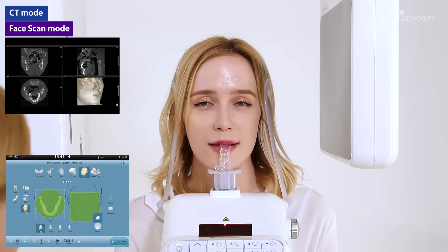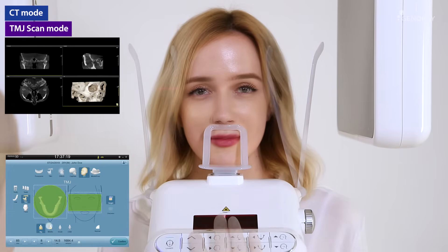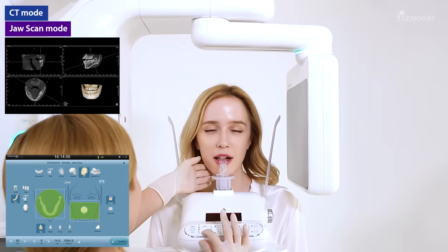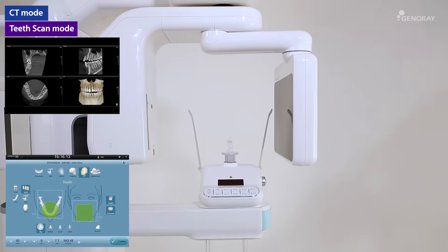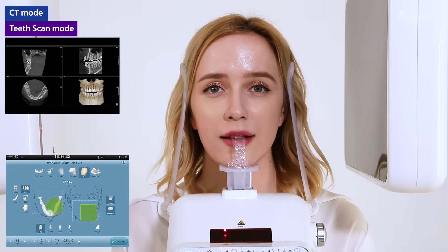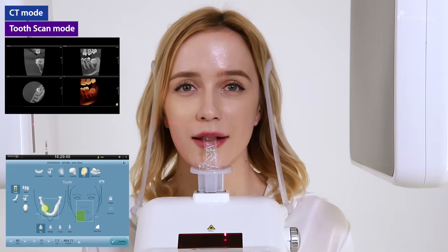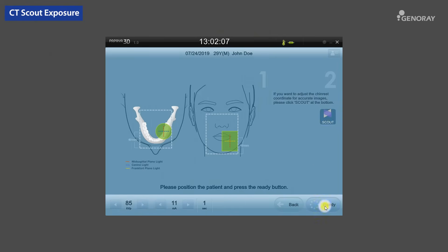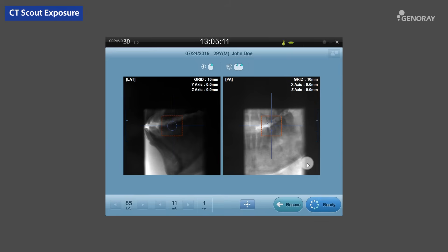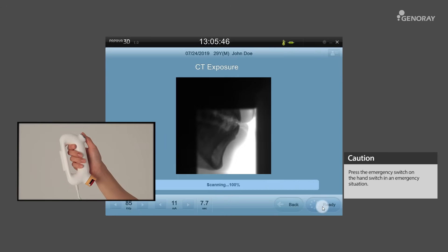After the initialization is done, guide the patient for the position and the bite stick. According to the scanning area, the system will automatically adjust the chin rest position. Before starting scanning, if you want to scan the accurate area of the teeth arch, click the Scout exposure button. Once the patient is properly set, select the Ready button on the OP and follow the instructions on how to hold the hand switch down until the exposure is completed.